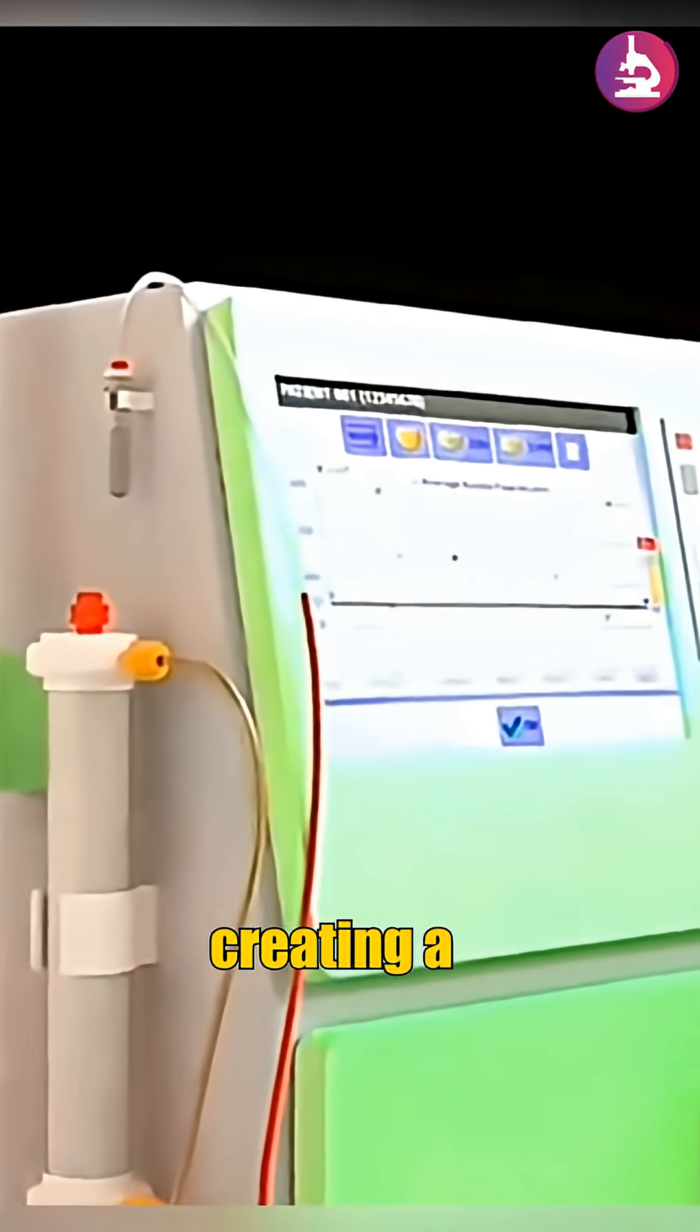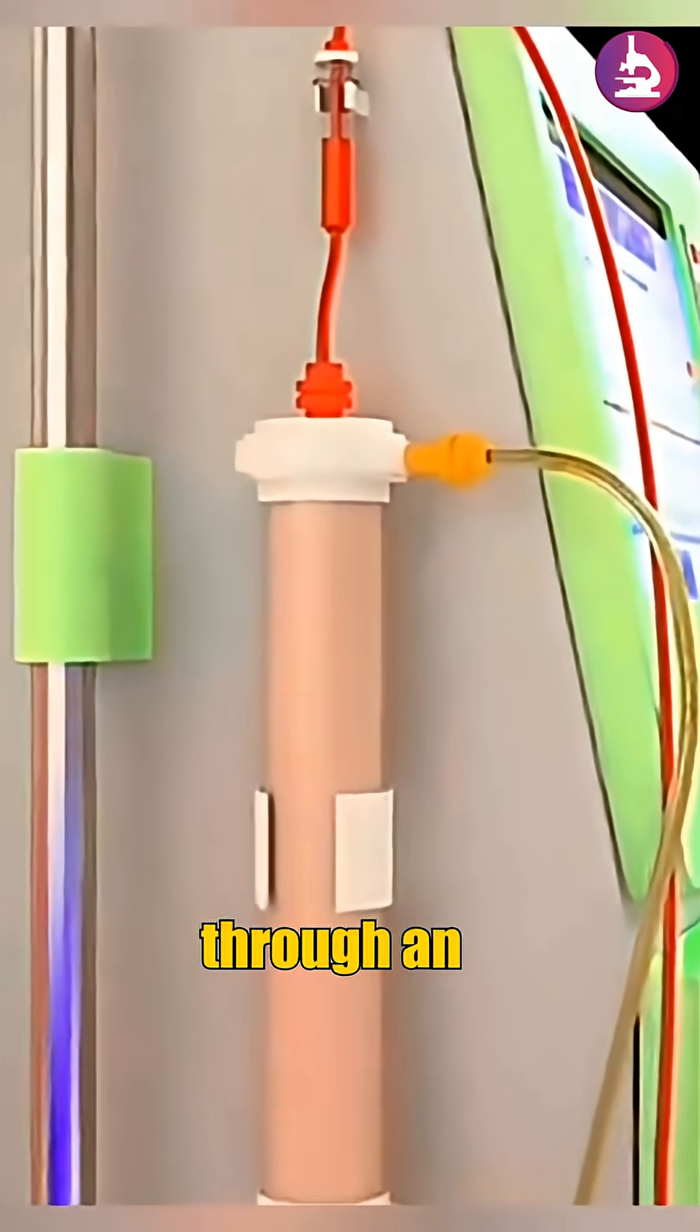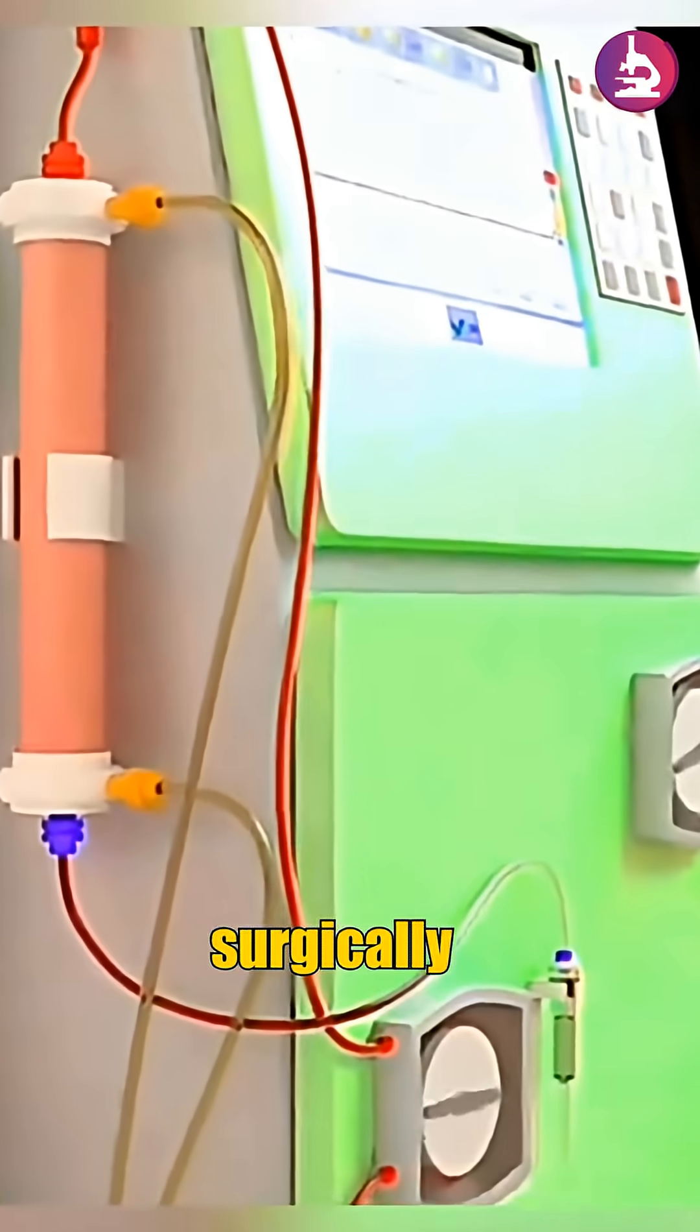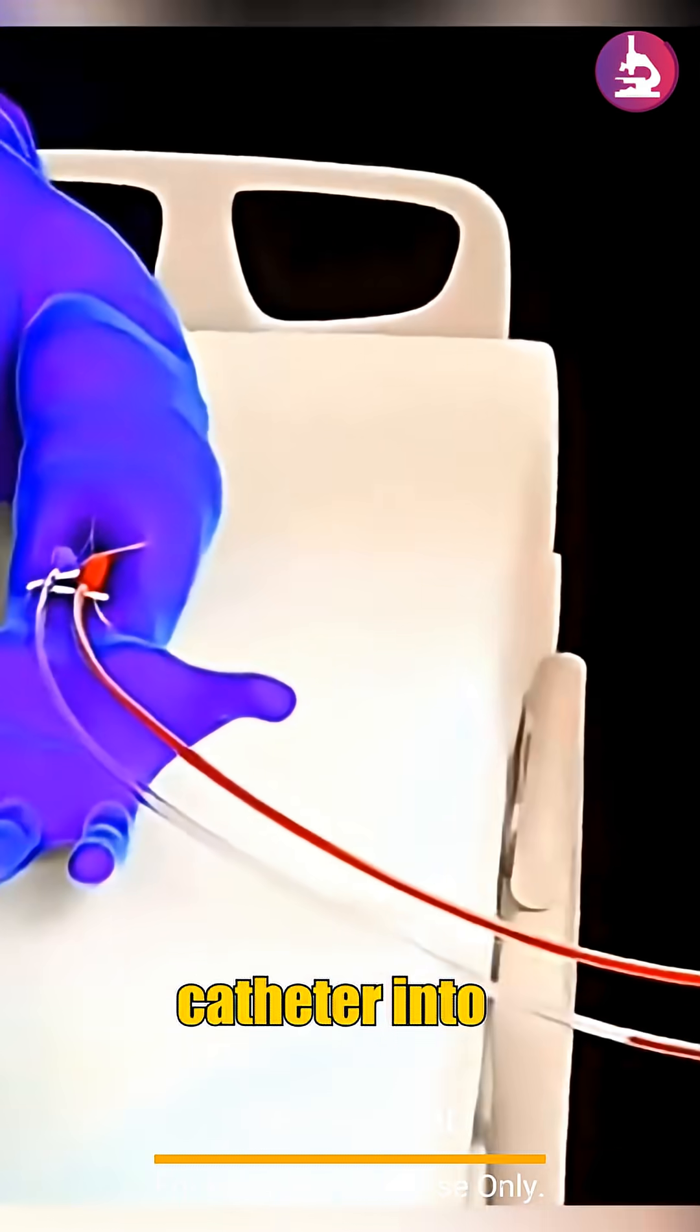The procedure starts by creating a pathway to the patient's circulation. This is most commonly achieved through an arteriovenous fistula, which is a surgically formed link between an artery and a vein, or by placing a catheter into a major vein.